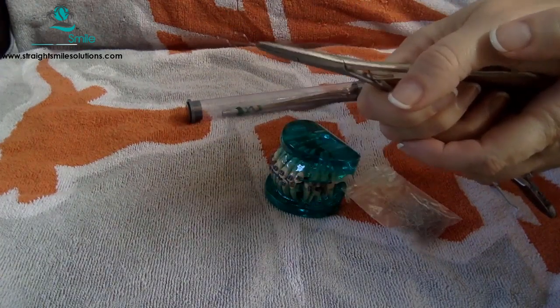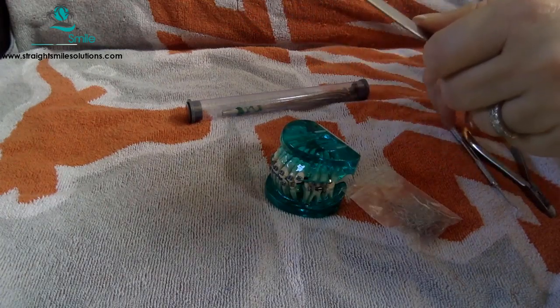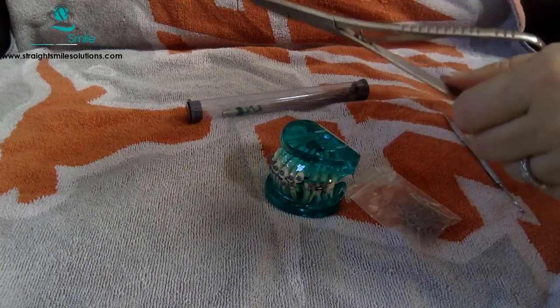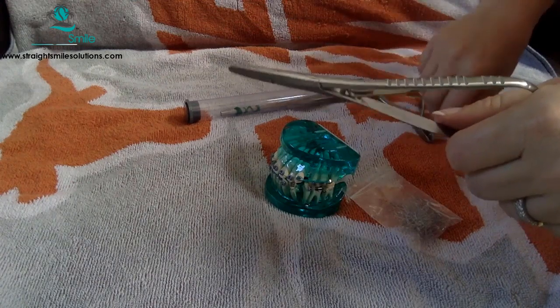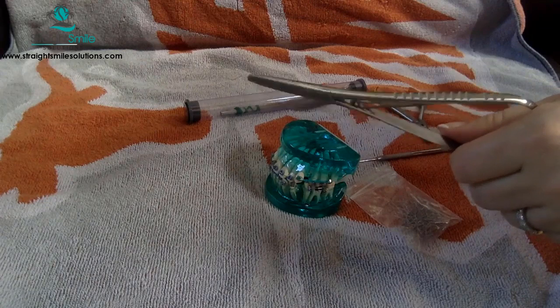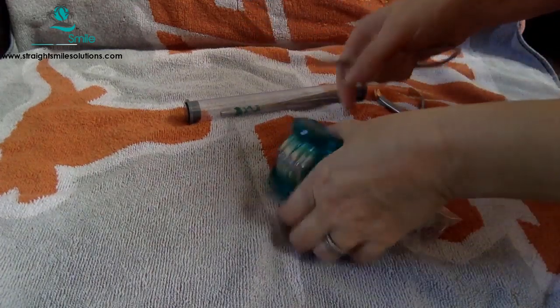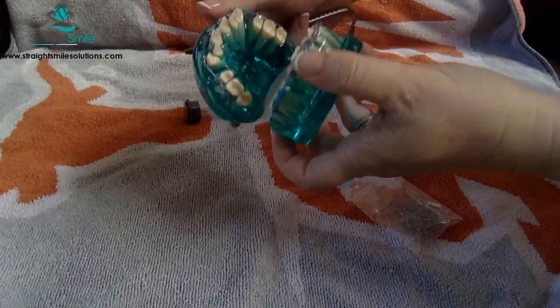This is a shorty. Grab it with your mosquito or Mathieu plier. This is your armamentarium here. Other things that you're going to need are a pin cutter or ligature cutter. And personally, I also like a ligature director if you do not have nails. Nails are the free version of a ligature director. Well, maybe not, they're kind of expensive, but they are the best thing in ortho.